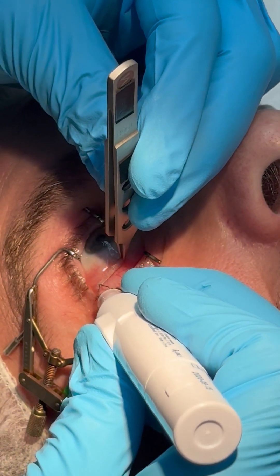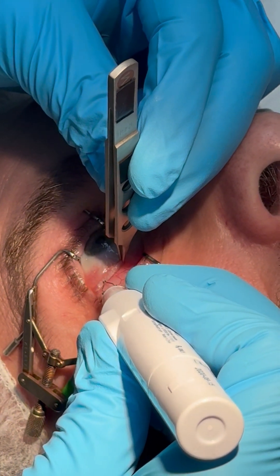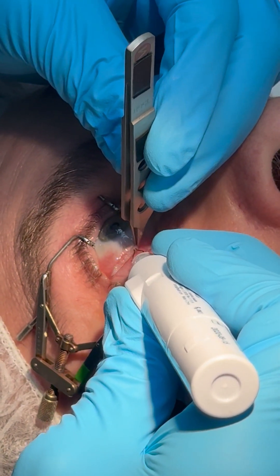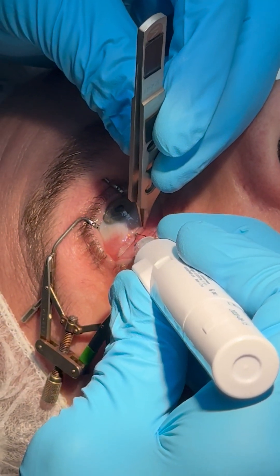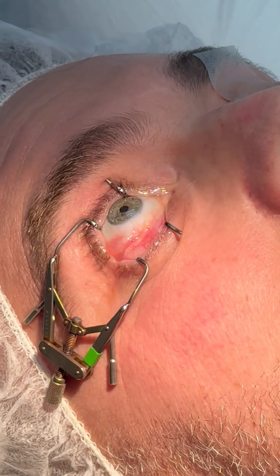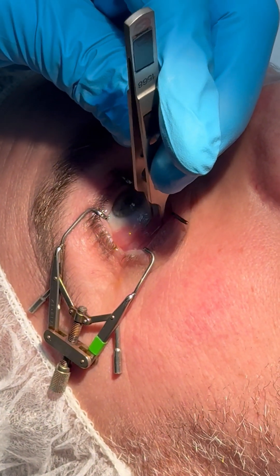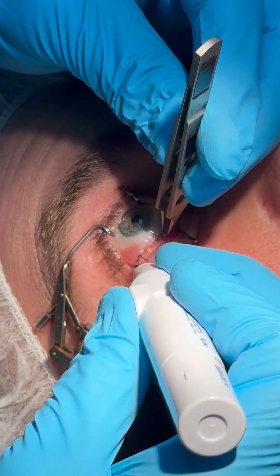When you get temporally, just be careful — don't get near the skin. The patient may say they feel some heat when you get more temporally. Just remember, you control everything. My finger is on the heat trigger, but if I want to take the heat off, I just have to take my finger off the trigger. So it's coming along nicely. We're almost done. You really don't have to do much to get that constriction for the conjunctivochalasis to go away and not be a problem anymore.